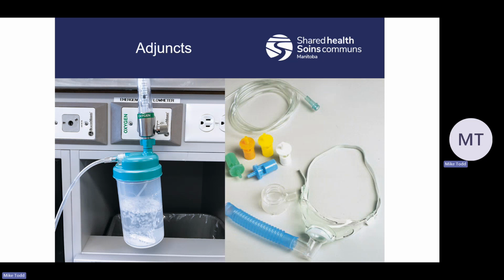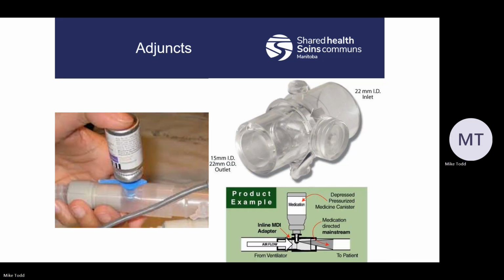Other things to consider here, just a couple of things. This might be one that you come across when you're doing an IFT: if you are providing supplemental O2 by a trach mask, it should be humidified. Because the air going into this patient completely bypasses the nasal and oral warming and humidifying that your body does as it goes down, it's going to be very dry. It's going to be very irritating to the respiratory mucosa. So ideally, if you're going to be transporting these patients, they should have humidified oxygen.